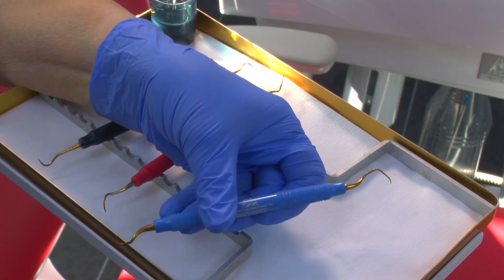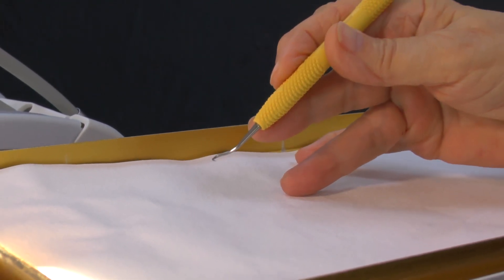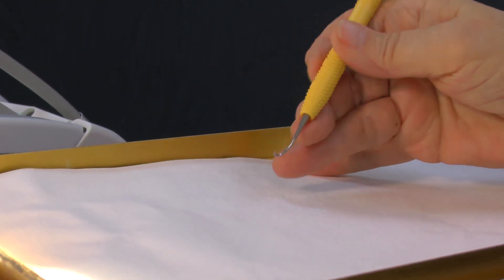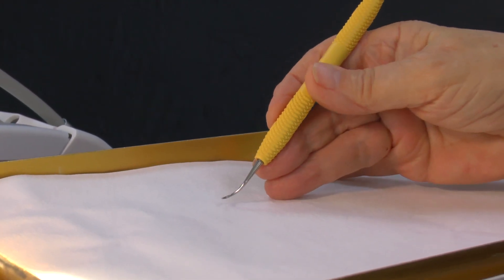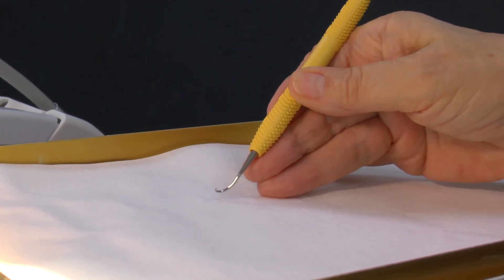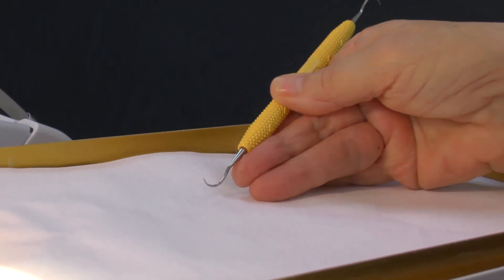Essentially when you pick up an instrument it is in a pen grasp, but if you rest only on your third finger it really doesn't have the power, and if you use your fingers to scale or debride the teeth it again doesn't have the power. So I have developed a technique — as a lot of other people have — of using two fingers and a wrist or arm movement to really get a lot more power behind the instrument.